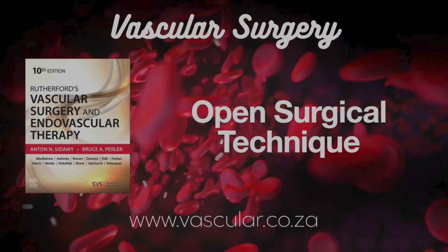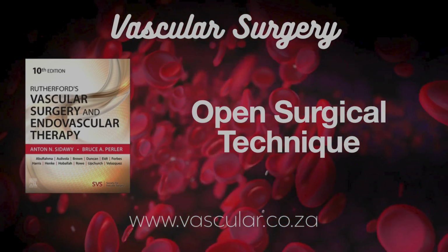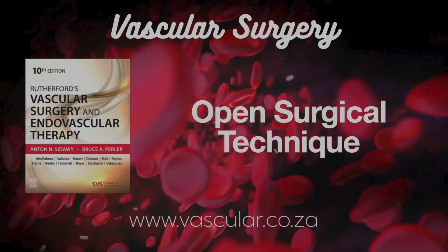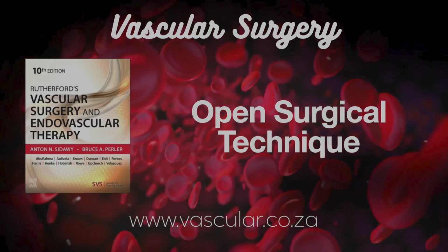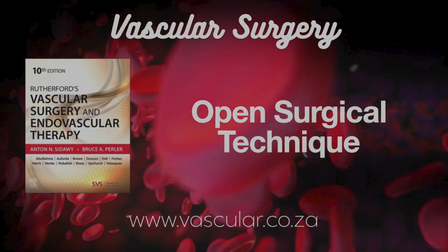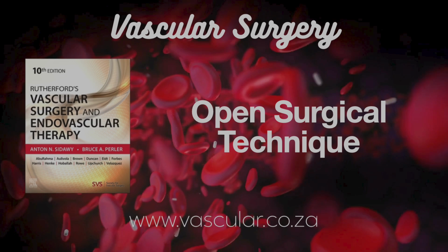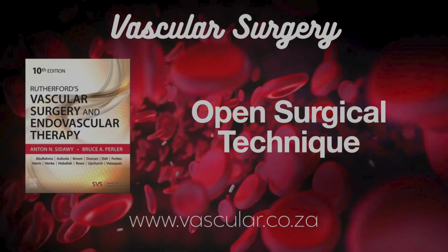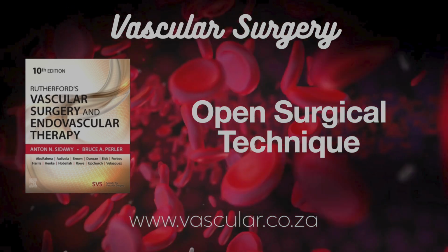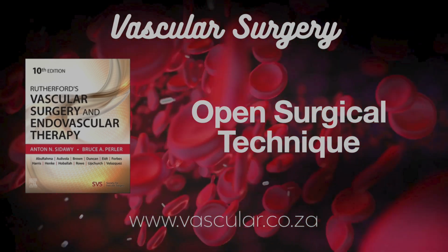Got it. So the vessels are exposed, tools are ready. What about the glue and the pipes? Sutures and grafts. Let's start with sutures. Right. For vascular work, you generally need non-absorbable sutures. Meaning they don't dissolve. Exactly. They need to provide lasting strength as tissues heal, or indefinitely for artificial grafts. And the type. Monofilament sutures, single strands, are standard for most reconstructions. Braided ones might be used sometimes, maybe for tying off small vessels. Okay. And they often come double-armed, a needle on each end. Yes, which lets the surgeon stitch continuously back and forth after the first knot.